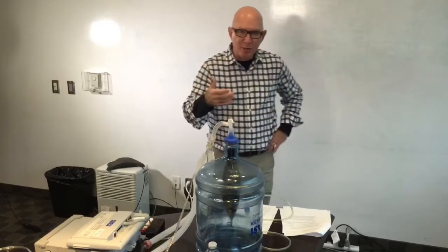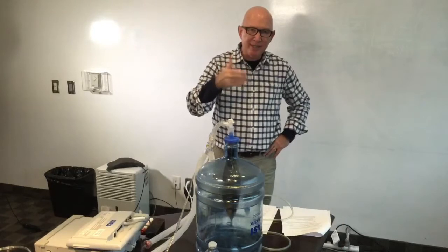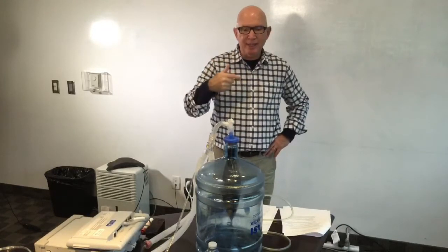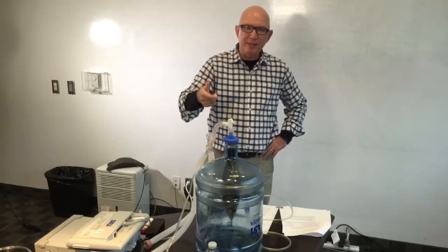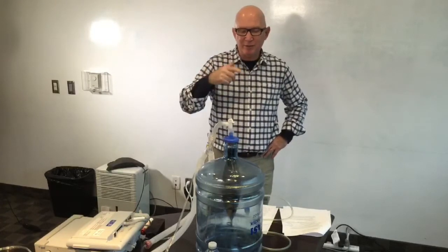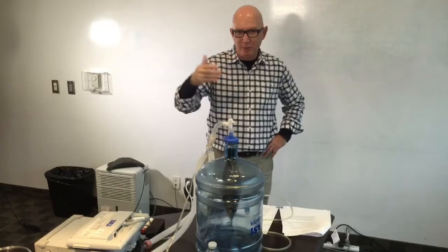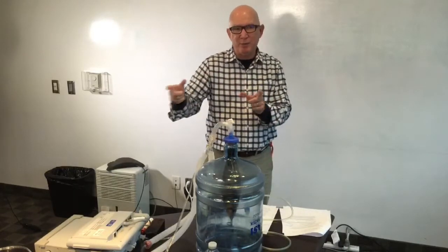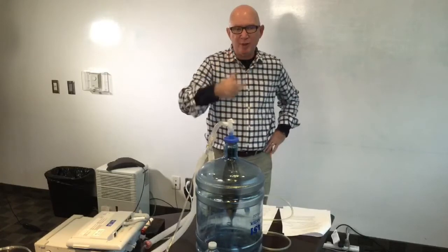So it's not uncommon while you're ventilating patients, even if you sedate them well, that they will breathe along with the ventilator. And when I said earlier about patients that were breathing faster than the machine, so for example, if you set them up at 16 and they want 20, those people are not just breathing 4 additional breaths from what the ventilator is giving them, they're breathing 20 times per minute.